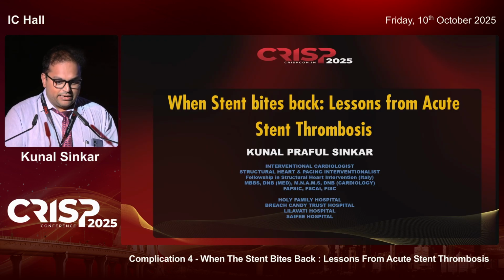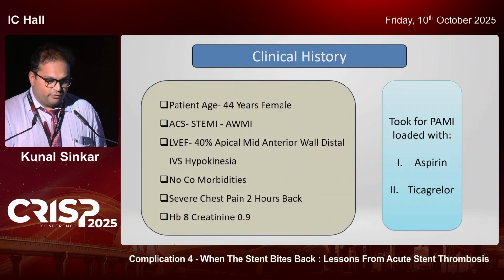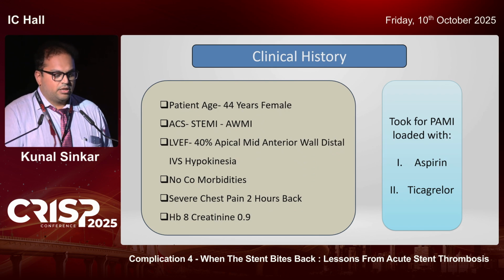When stent bites back: lessons from acute stent thrombosis. This is a recent case done last month. A 44-year-old female came with ACS, STEMI, anterior wall MI. LVEF was 40%, no comorbidity, severe chest pain 2 hours back.